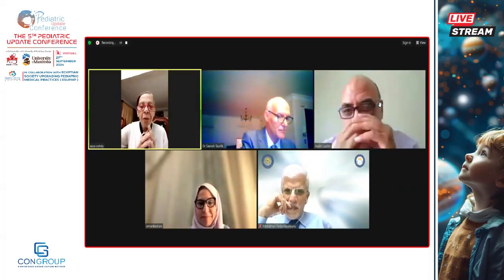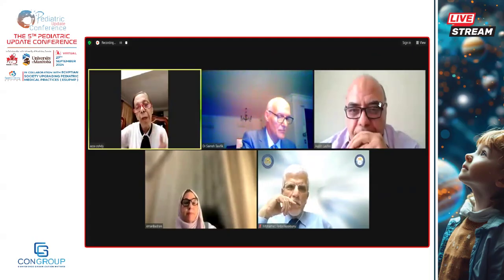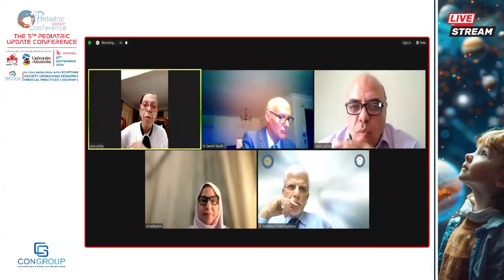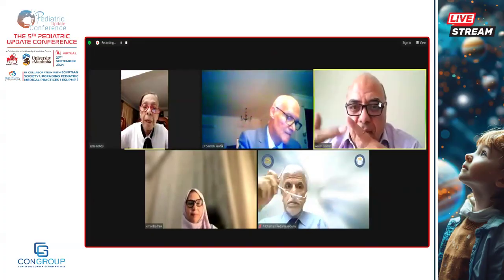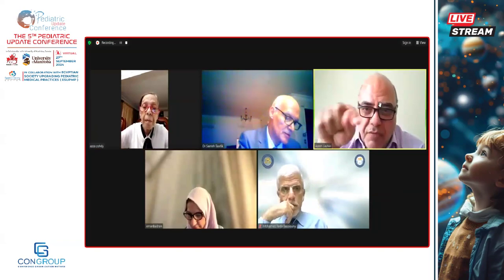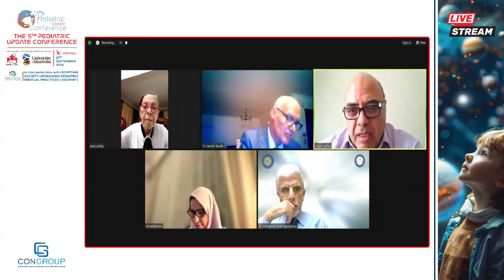Okay, may I ask you, Dr. Assem, the probe you are using, the power of the probe, is it the same for all the areas? I mean, the one that you are using for the cranial ultrasound, is it the same probe with the same power that is used for the chest or lung and abdomen and heart, or it differs? We used to use the curved one for the head. Yes. For the pleural effusion in the costophrenic angles, which is the curved probe, as well as assessment of the liver in the abdominal ultrasound.